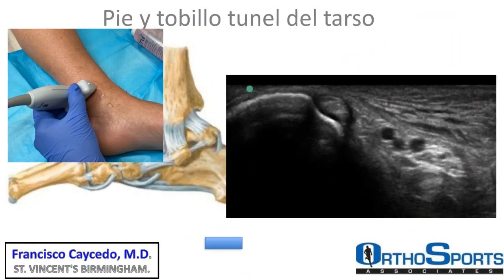The medial aspect is very beautiful and I am very excited to show you this. I call it the Mickey Mouse sign. And Mickey Mouse means the head is the artery and the veins are the ears. And when the patient has a contraction of the gastrocnemius, they change the way they walk, and they try to do hyperpronation. That produces stress in the posterior tibial tendon, and they can develop a tenosynovitis. So also decreasing of the arch from laxity of the spring ligament.